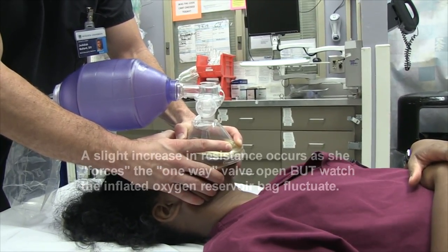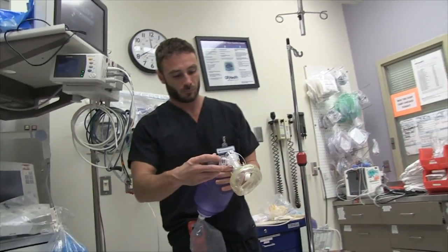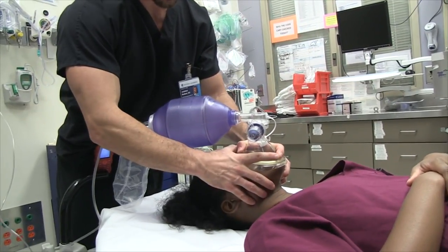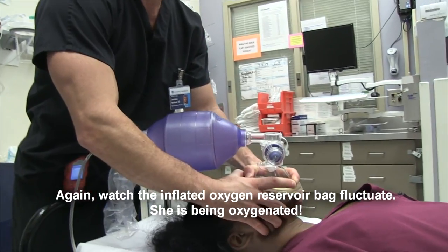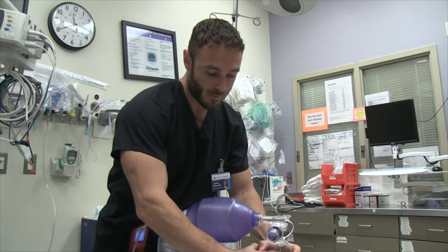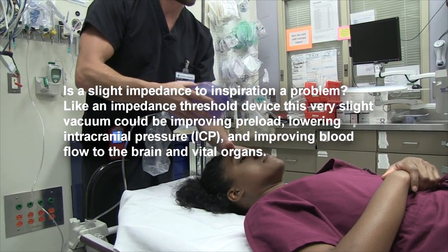Get one more breath. Is this where the air is moving? Well, put a PEEP valve on there, and let's see if that makes any difference in her ability to breathe. Same thing. Get that nice seal, and since I'm not actually bagging, we're just going to go two-hand. It's a more reliable seal. You can hear it coming out that same hole right through the PEEP valve. It sounds like the expiratory pressure is a little bit higher. It's a little bit slower. So she's getting a little PEEP on there, but she's easily moving air in and out with the bag.